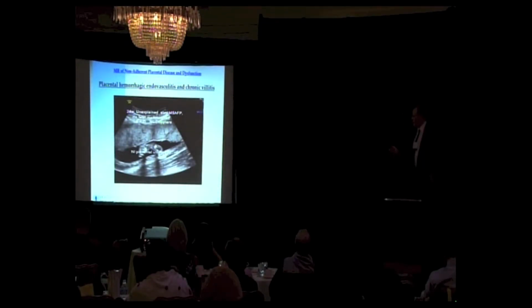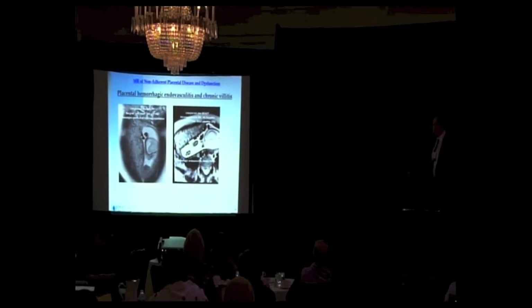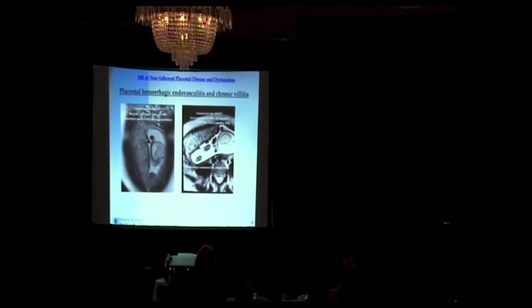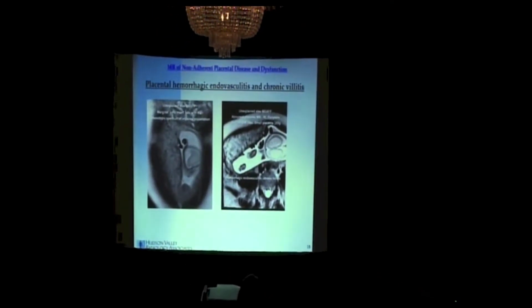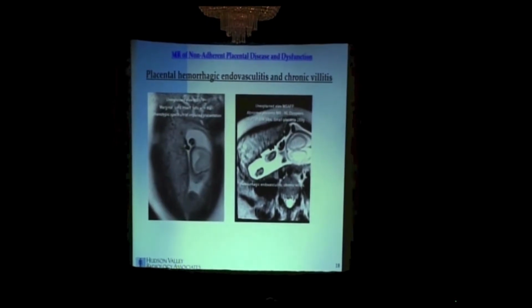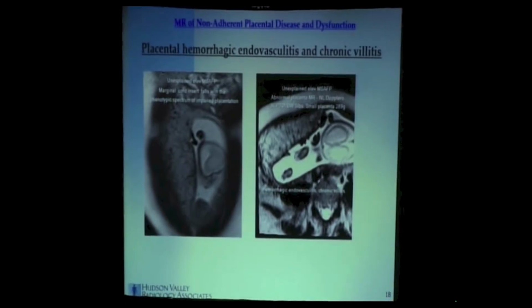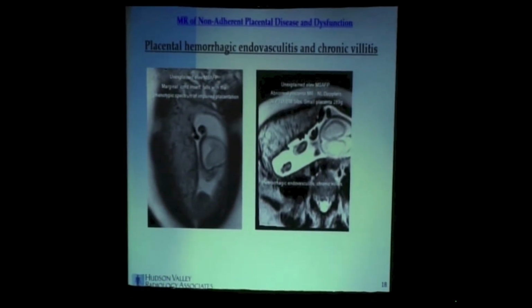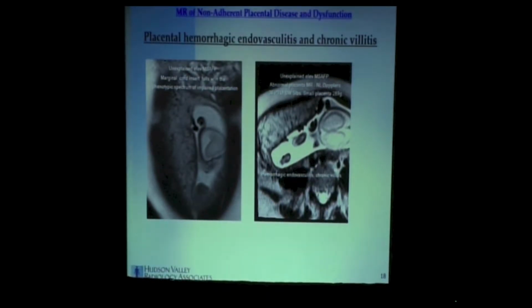So, a normal placenta on ultrasound, seemingly homogeneous. Remember, this patient had normal Dopplers. On MR, this is a marginal cord insertion here, and we see on MR these multiple parallel hyposignal intensities. So not only is this a heterogeneous pattern of signal intensity, but there's an organizational component to it. Too many straight lines traversing the placenta in its entire depth.